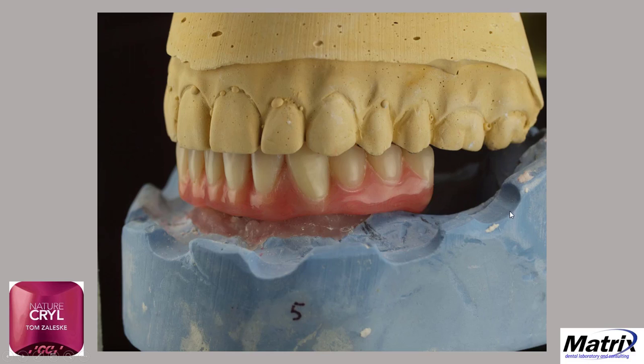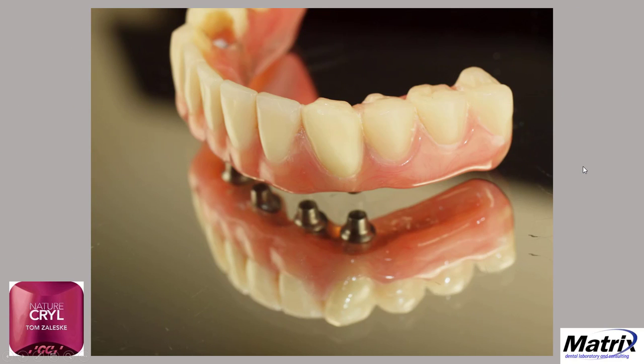The acrylic really polishes up really nice. You can see it looks exceptional. It's an exceptional repair. There it is off the model and underneath, so you can see exactly what's going on. You can see my half a molar. And again, nothing fancy here. It's a repair. No need to do any characterization or anything. I just want to get it done, make it last and hold up. And I'm hoping with the e-glass in there and with Bob Hicks's professional repair, that'll last.